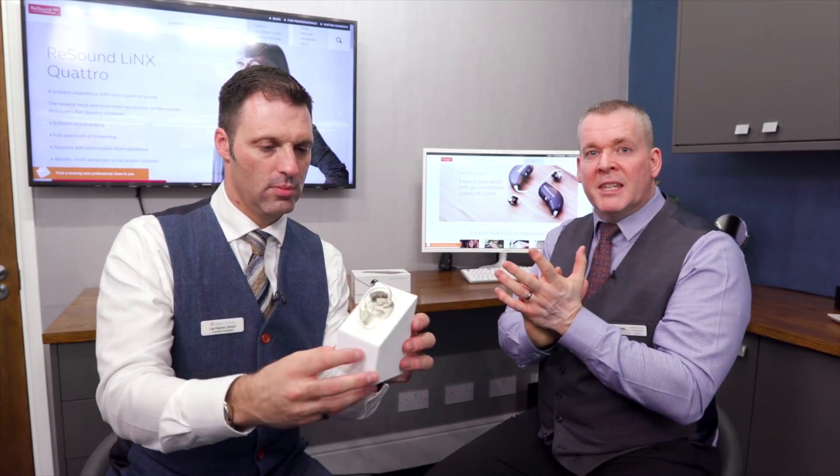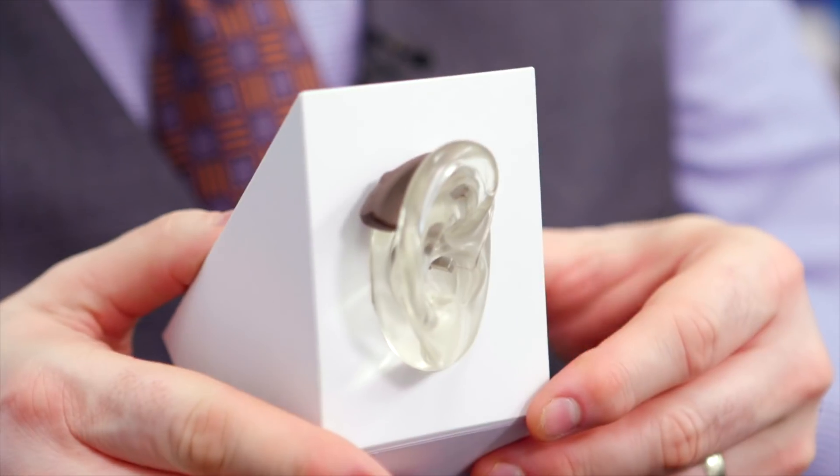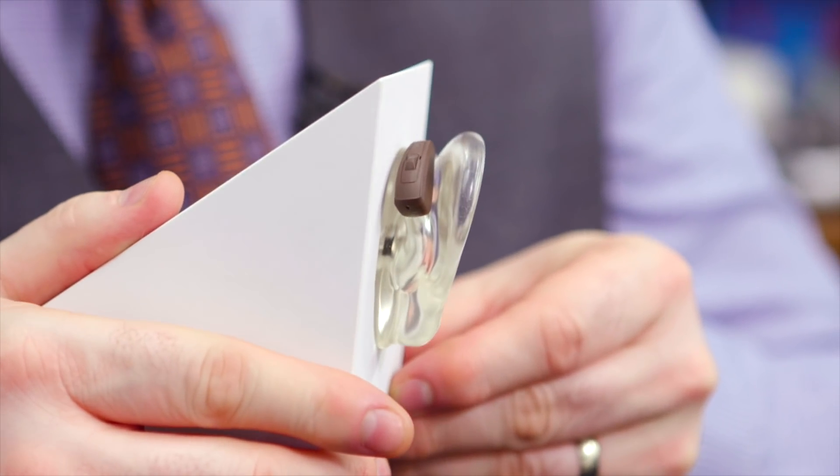What I like about it is the app gives a lot of freedom to the end user. When I've used them to sample the hearing aids, I've been able to go to my local coffee shop in Marylebone and create a program where I can direct the microphones, increase the noise reduction, give some extra high-frequency gain, then save that as an individual program. You've got a lot more freedom than you do with certain other apps. You can also connect to a range of great accessories.